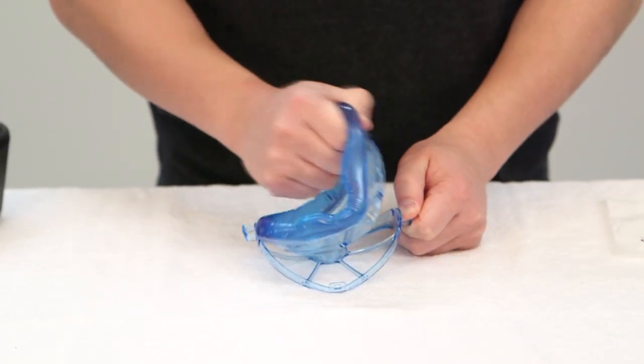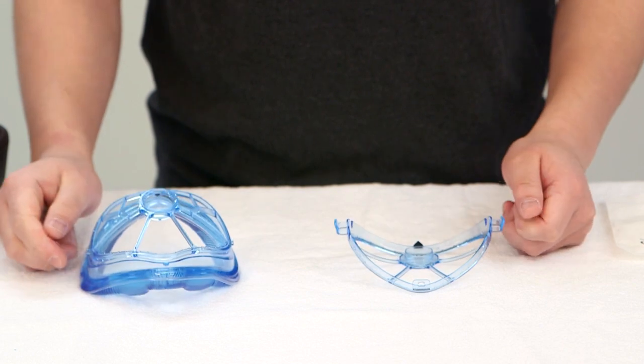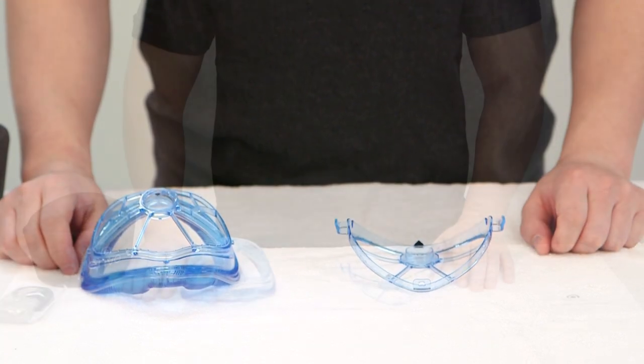When pulling on the tab, it is important that the direction is away from the center and not in an upward direction.